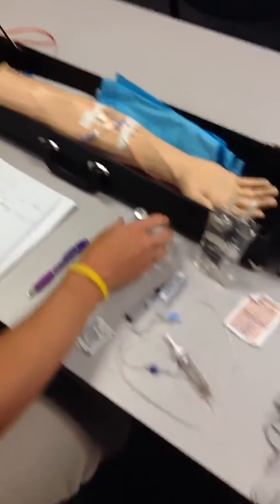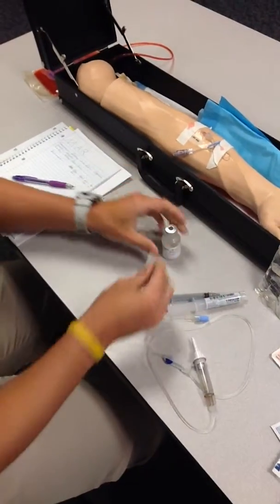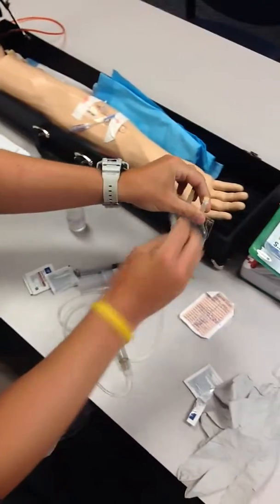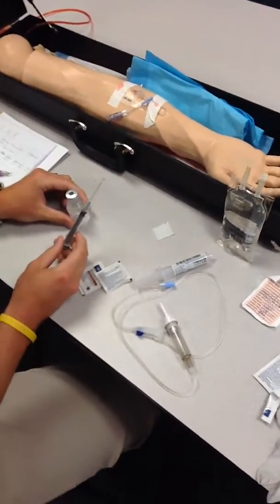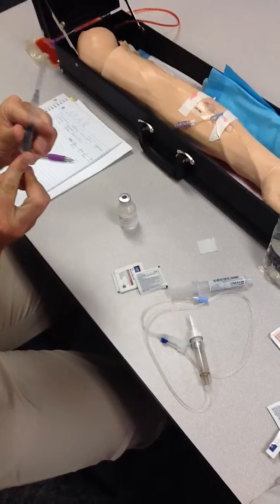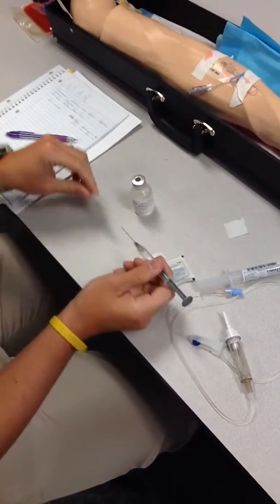I've washed my hands. I've gathered the materials that are necessary. We will clean our vial and all the prep sites that we will have to inject into to sterilize. We have a syringe with a sterile needle that has not been used. Draw the 2 milliliters of air that we need to instill into the vial.